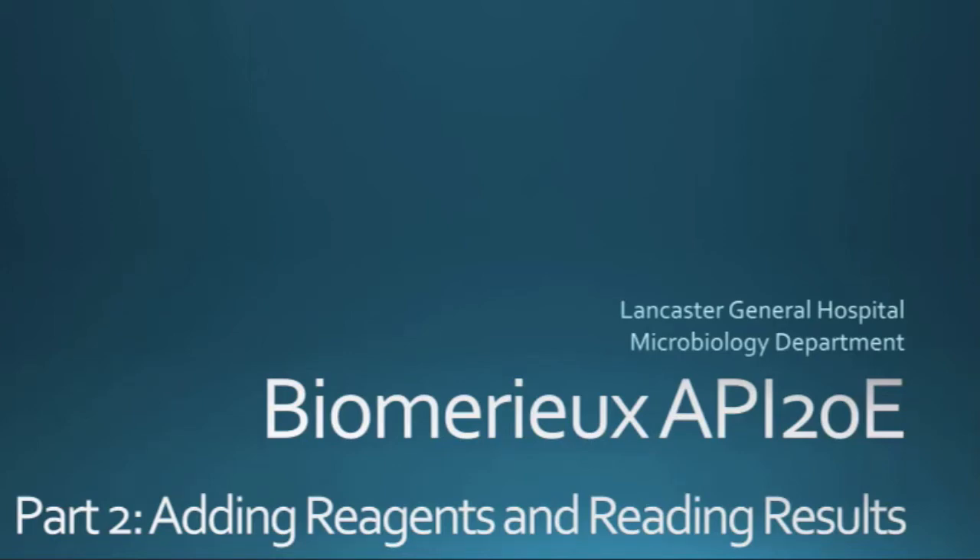Welcome back! Now that your stuff has been incubating overnight, it's time to add the reagents and read the results of your API.